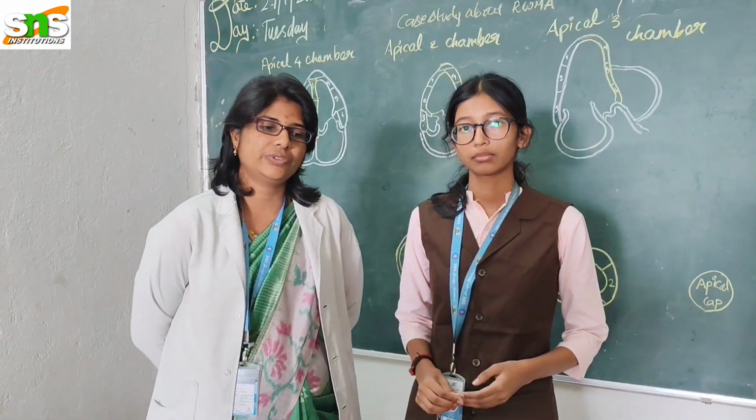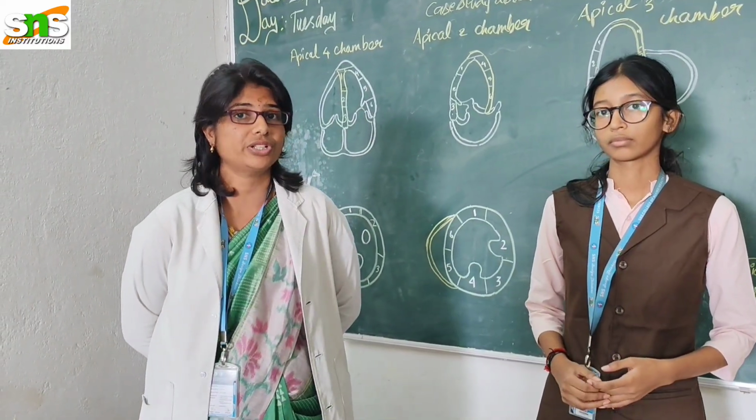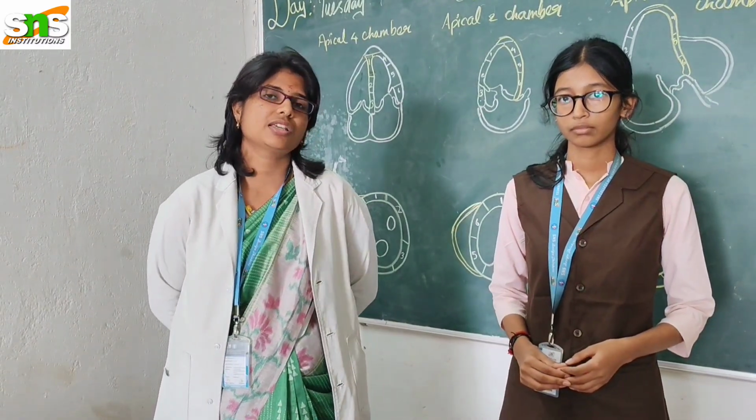So here we noted that there is no ST elevation, ST depression is noted in V4 and V6, and the biomarker troponin is elevated. So these things also confirm the presence of angina, ischemic heart disease. And next point.